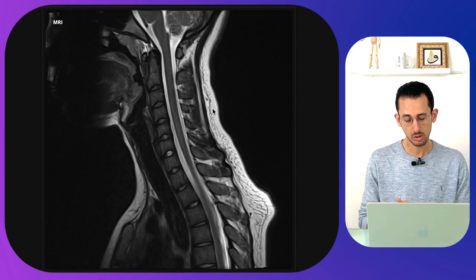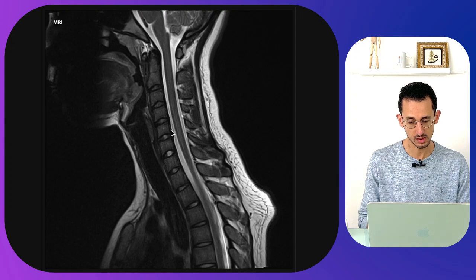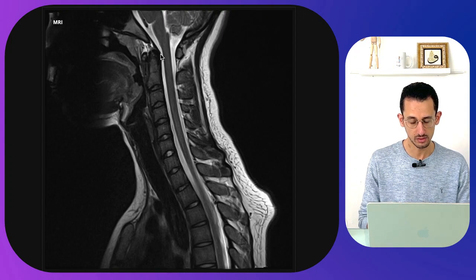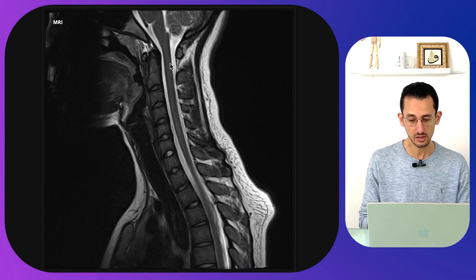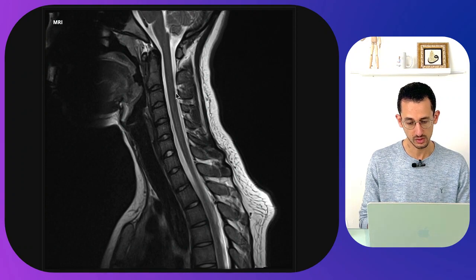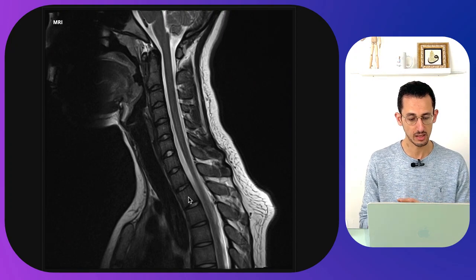In this sagittal image I can't see any abnormality. There is no disc prolapse causing pressure on the cervical spine. The flow of the CSF looks smooth all the way down, there is no abnormal signal within the spinal cord itself, and no abnormal signal within the rest of the structures. This looks like a normal sagittal MRI scan.